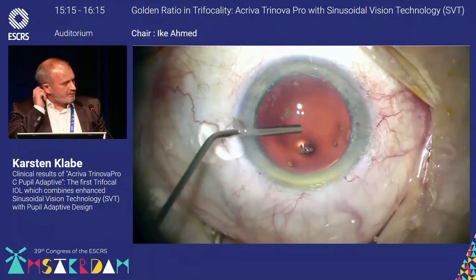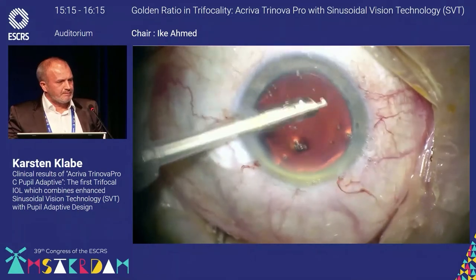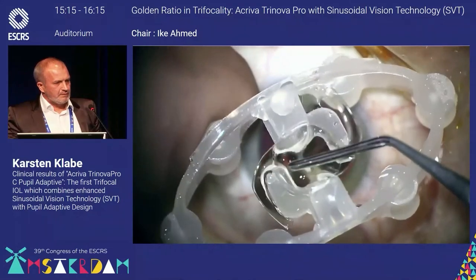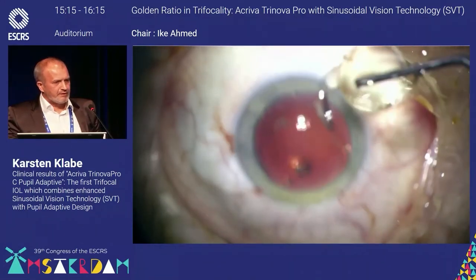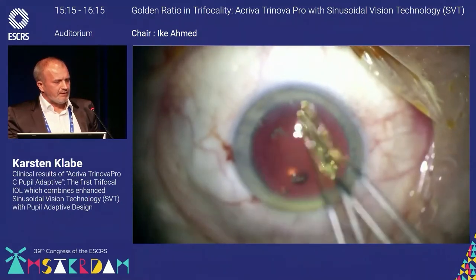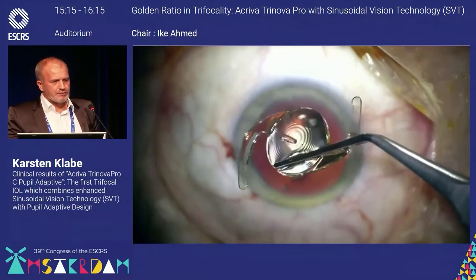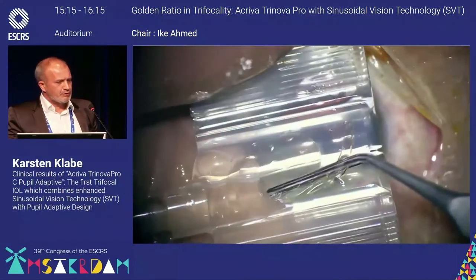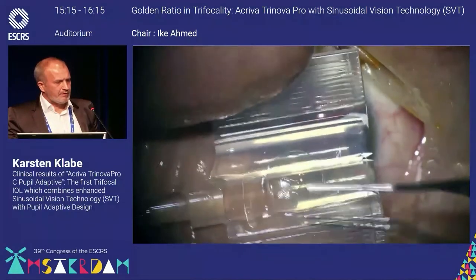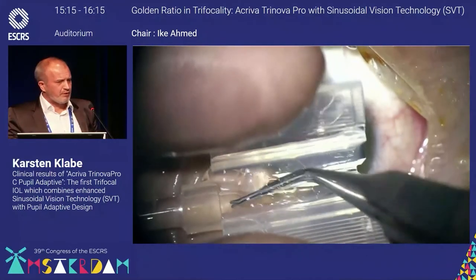Here we go, some viscoelastic. Capsule tension ring first. And here we go, the new Trinova Pro, a modified C-loop haptic. In this case, we used our standard shooter system, the Medicel shooter. The incision size is 2.2 millimeters, and the injector fits well with all of these models, and as well with the Trinova Pro. It was a lens of about 24 diopters.